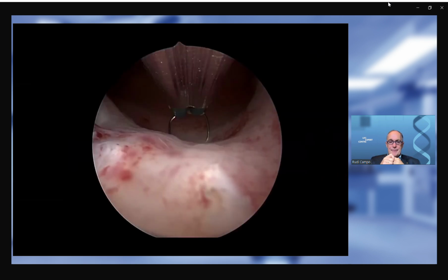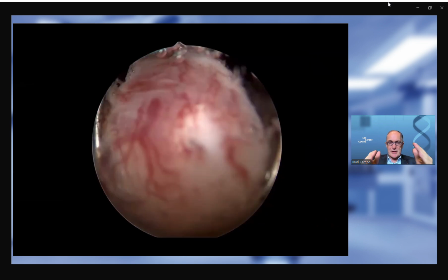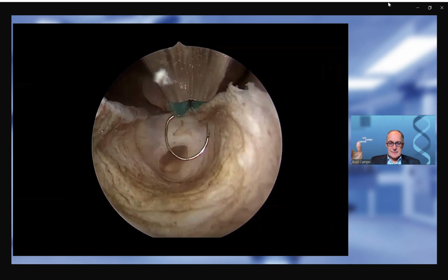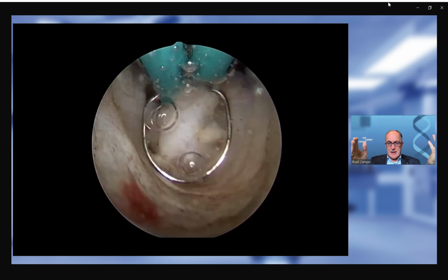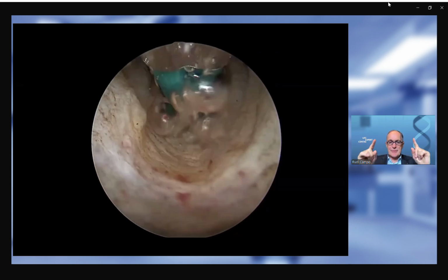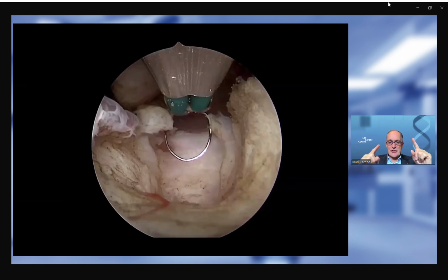Next step, resection in the midline. You cut in the middle of this lesion and you look, the cyst. You see cyst, so you take the cyst away, but you also see and recognize, and this has never been described until today, you recognize the adenomyotic tissue.